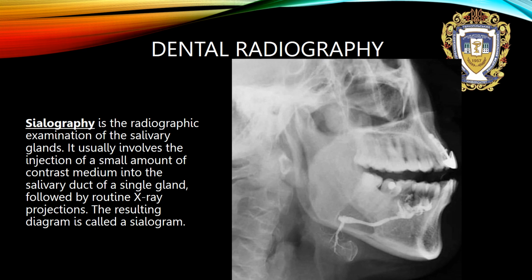They are shown: submandibular salivary gland sialography.